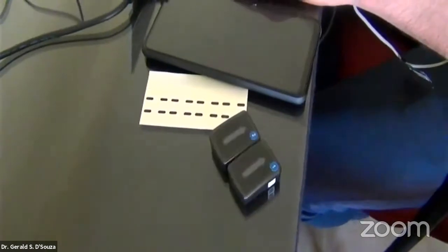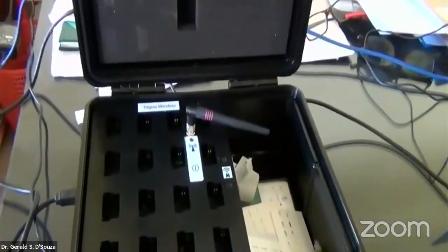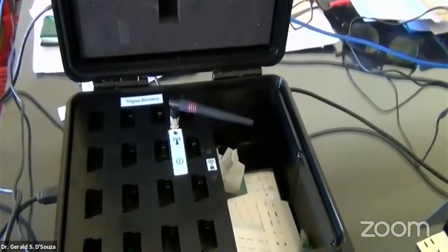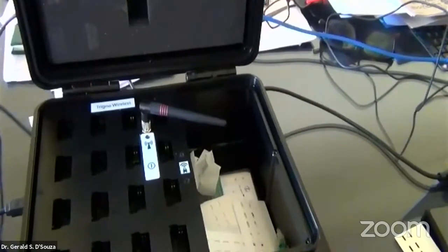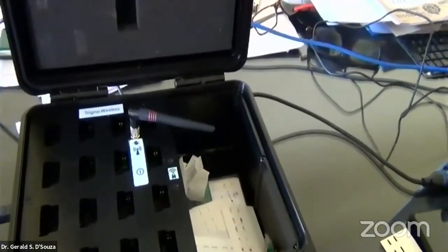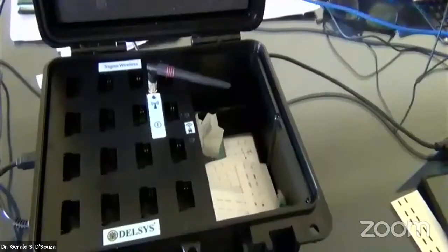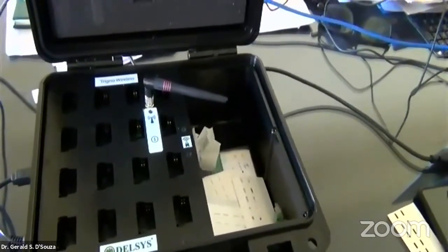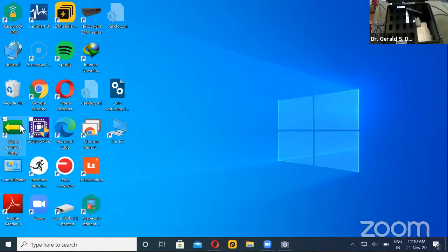I'll share the screen. So now this is the Trigno Control Utility to pair the sensors.